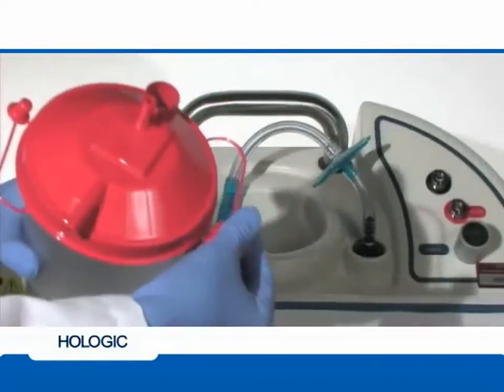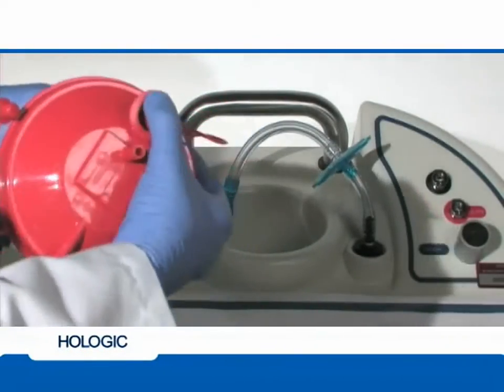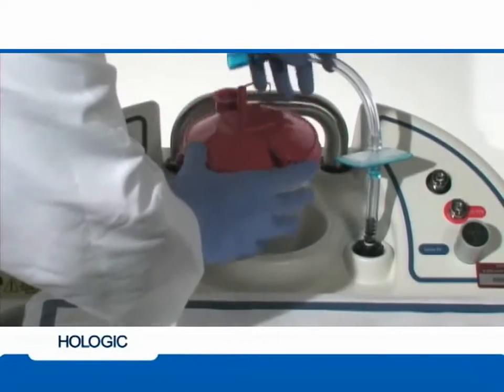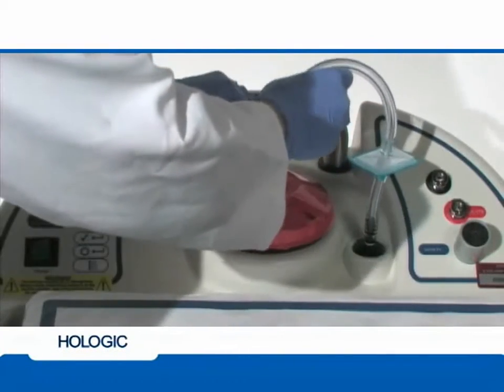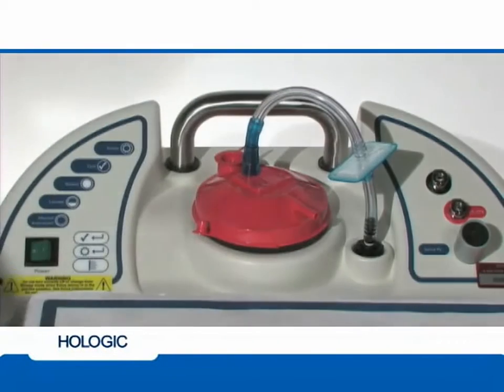Place the vacuum canister lid tightly onto the canister, making sure to cap off the large port in the lid. Place the canister into the holder on top of the console. Connect the blue fitting of the vacuum line assembly to the vacuum port located on the top of the canister.